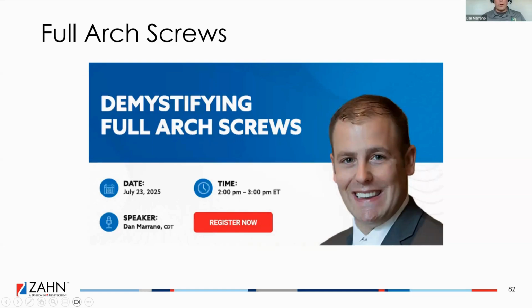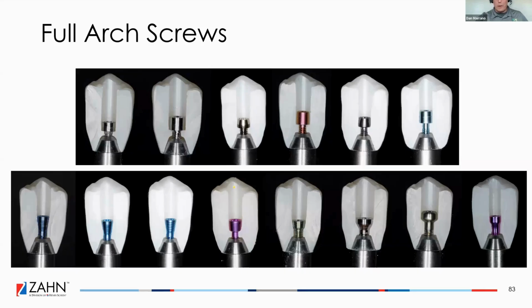So full arch screws, we just did this webinar last month. I'm not going to go through the whole full arch screw webinar again. Just going to give you a brief overview. There are still screws coming. We just had Powerball 3.0 and there's some other screws that still haven't even been put on this list yet. So just keep in mind, you might be asked at any time to manufacture a restoration with these screws. You have to be prepared for it, and that's why I go through all of this, to make sure that I can mill it properly.